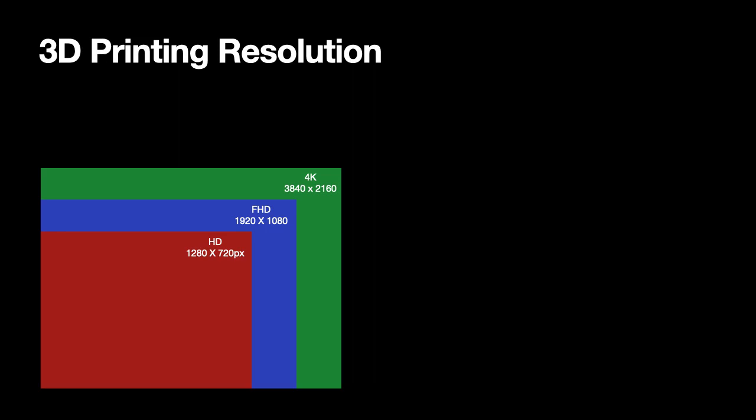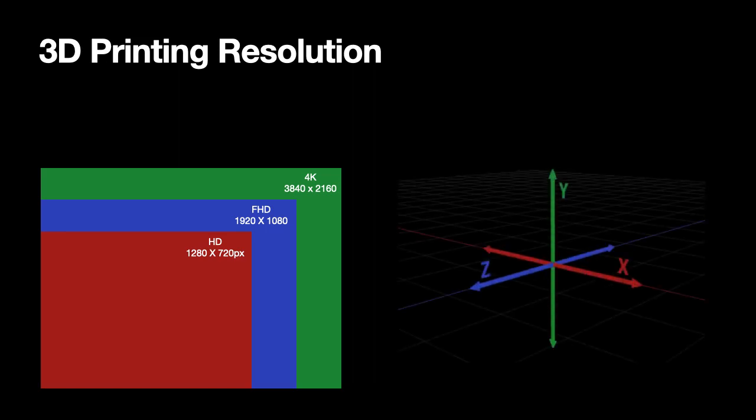Besides, you also need to understand that we are doing 3D printing, so you need to consider all three axes, the x axis, the y axis, and the z axis. The z axis being the layer height. So the high resolution comes with a trade off, longer print times. So you could have 25 microns to 100 microns. So that's something that you need to decide based on the indication that you're printing. So that brings me to the next subject of accuracy and precision.